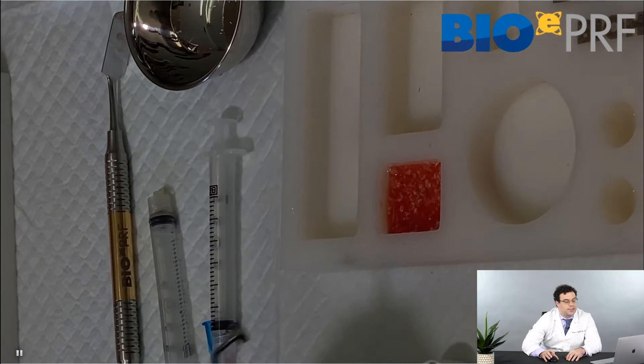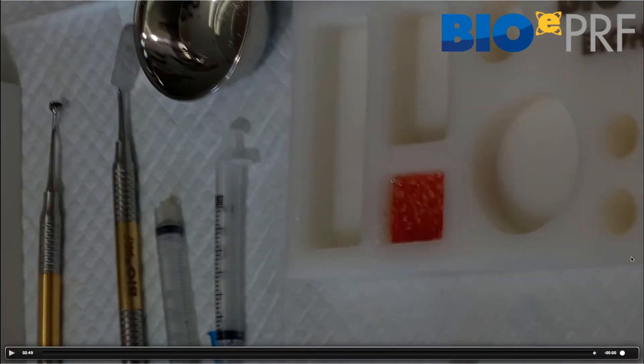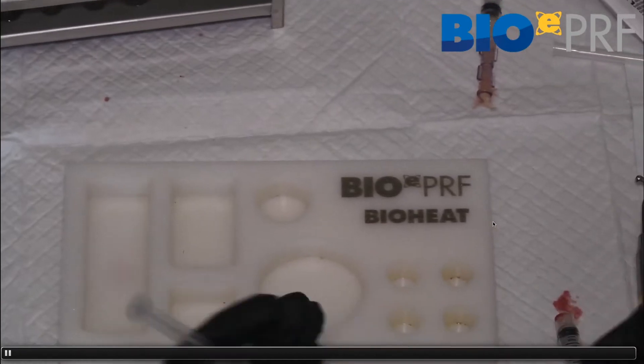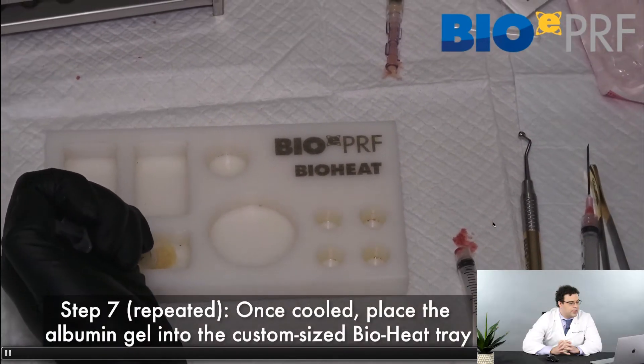The nice thing about this is that one side is composed of the sticky bone layer, which can go against bone, and the other side is the extended PRF membrane. Here's another video that's going to go over this once again, so doctors watching can be confident they can do this in their offices.